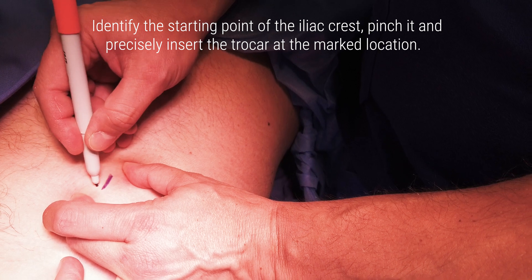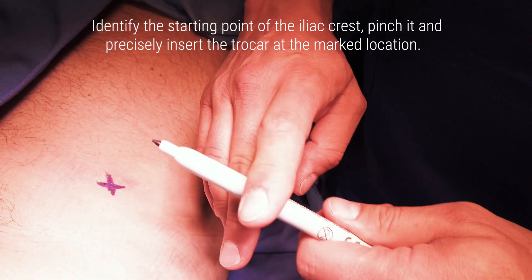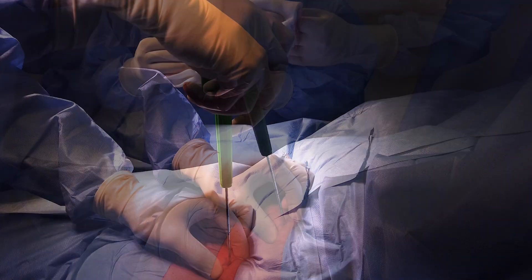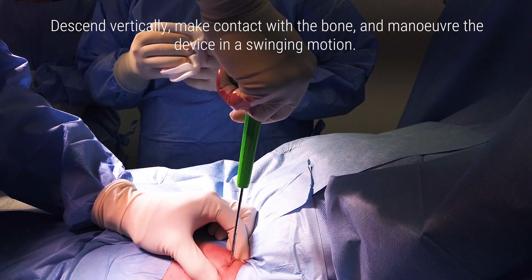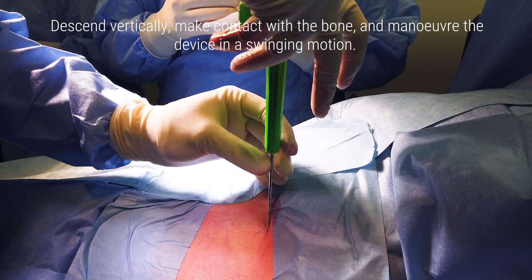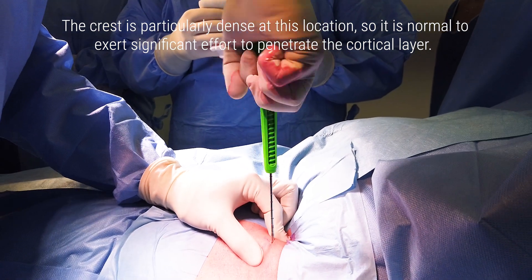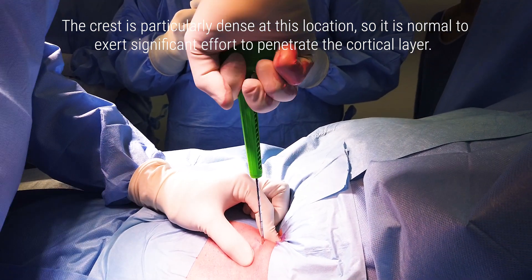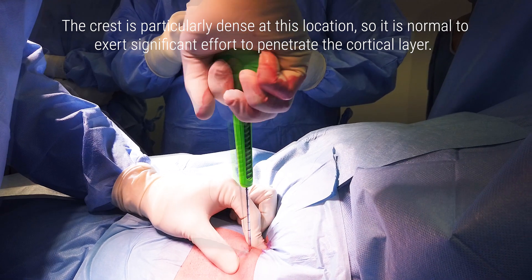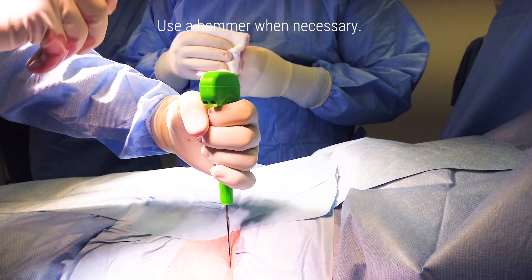Identify the starting point of the iliac crest, pinch it, and precisely insert the trocar at the marked location. Descend vertically, make contact with the bone, and maneuver the device in a swinging motion. The crest is particularly dense at this location, so it is normal to exert significant effort to penetrate the cortical layer. It is crucial to maintain control of the movement. Use a hammer when necessary.